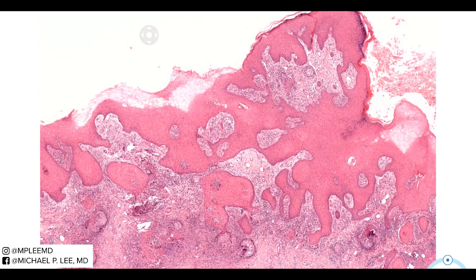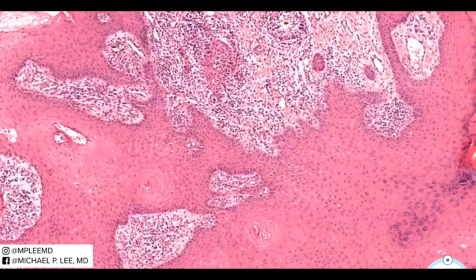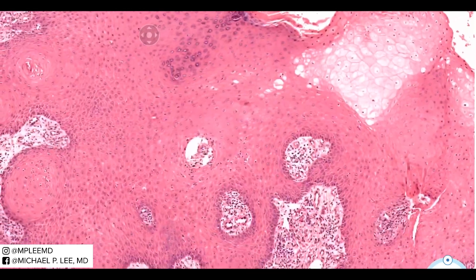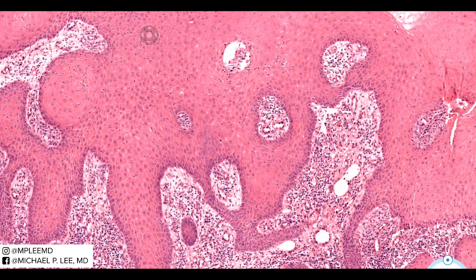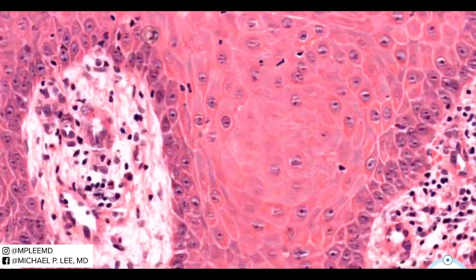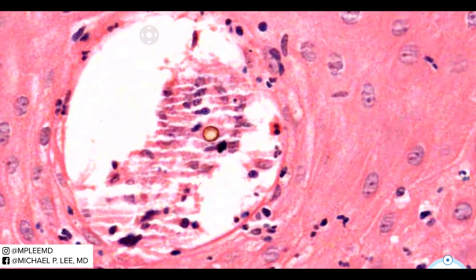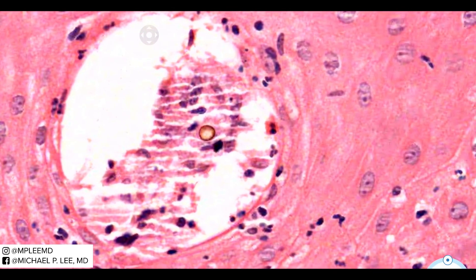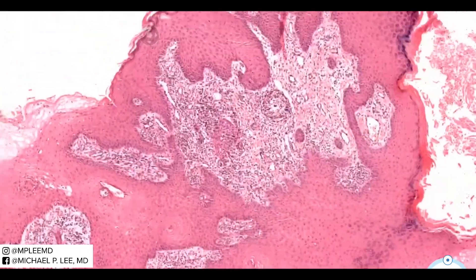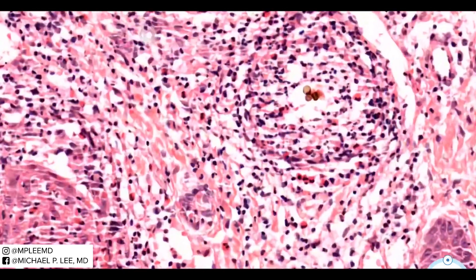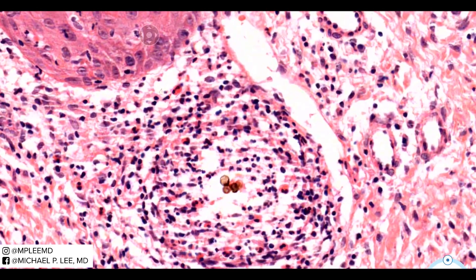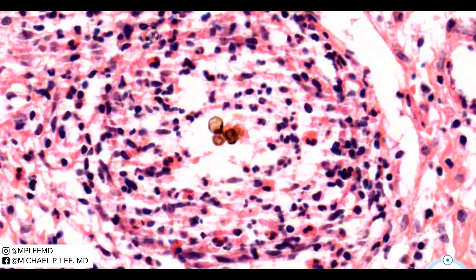This example I believe is chromomycosis. There's not that many organisms in this case, but I did find a few — here's a nice little round yeast form structure that's pigmented. And I think there was another cluster up here — yes, there you go. There are no hyphal forms, not that many organisms at all, and they're just these round structures that are close to each other.